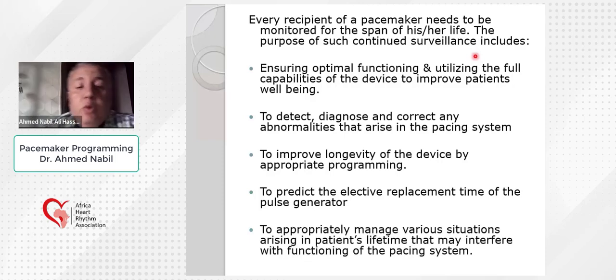And finally, to manage all the situations that the patient can have during his lifetime, which may interfere with the function of this pacemaker. So we have many goals for programming. It is not just for measuring the pacing threshold only, or measuring the longevity only. We have many goals for programming to achieve better performance of the pacemaker.